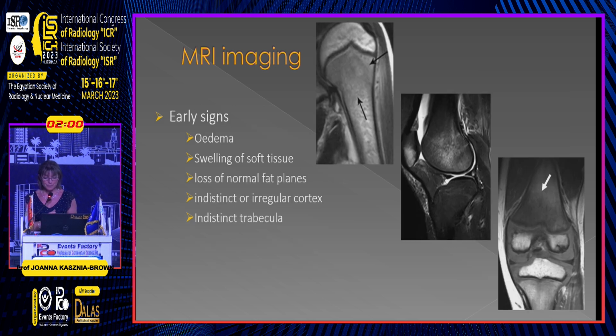the surgery. And you can see here how quickly the signs of infection, the early signs, mainly the edema, can be visible. And you can see the example on the T1 image, very, very subtle edema here within the metaphysis, and much nicer visualized, the edema more advanced, on the STIR image or the edema on the T1 image.